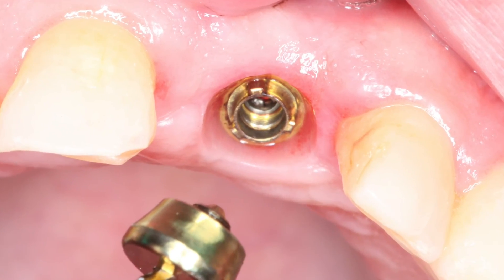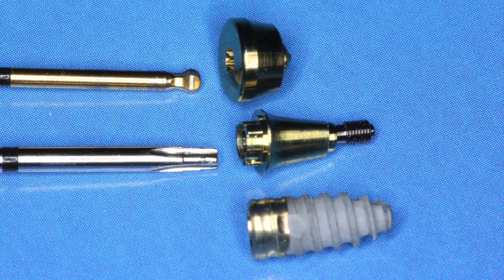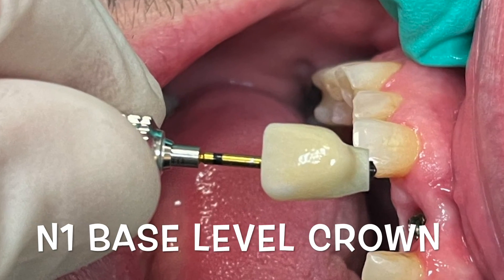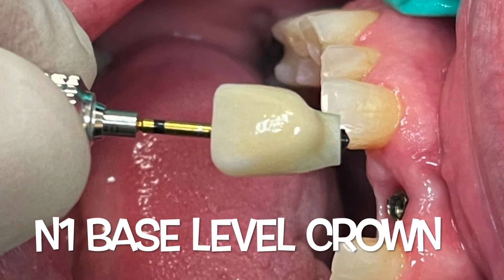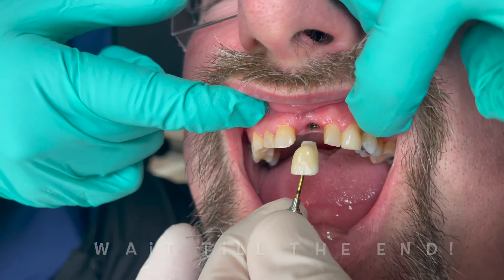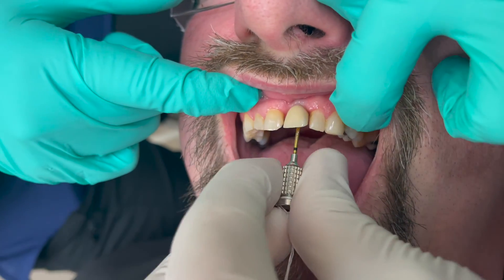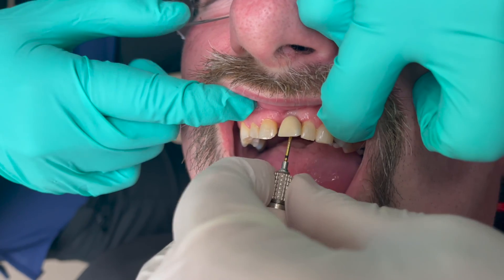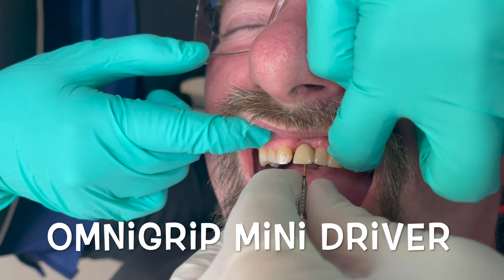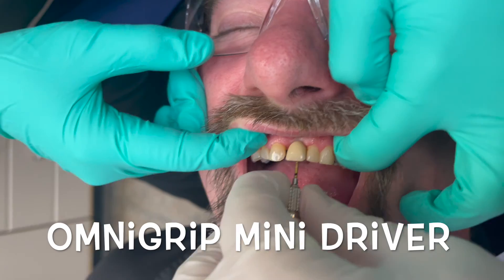Looking down in here you can see the junctional epithelium. The connective tissue is covered over, and we've got the implant, then the base level abutment, and then the anatomic abutment. When you come to do the crown, the emergence profile is preset by the anatomic abutment. We used an OmniGrip mini screwdriver, which comes with the Nobel system from the N1 kit, and we're placing this implant crown.